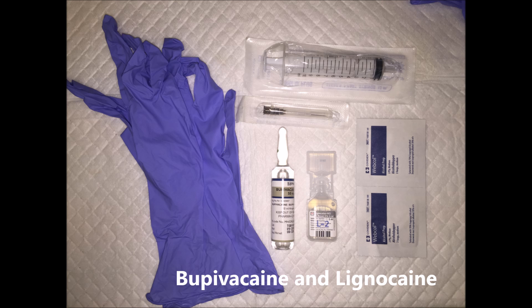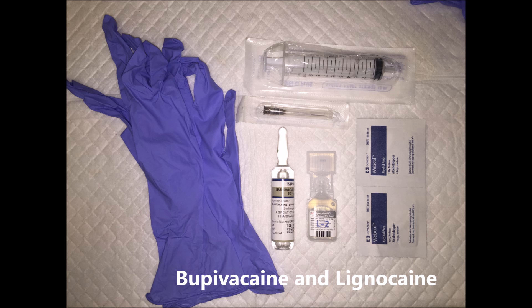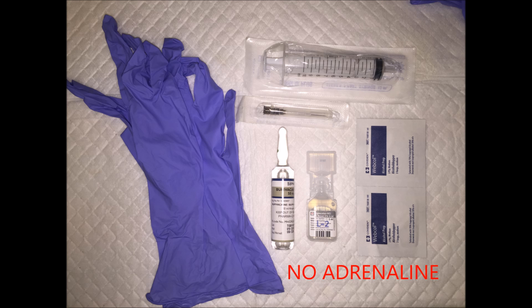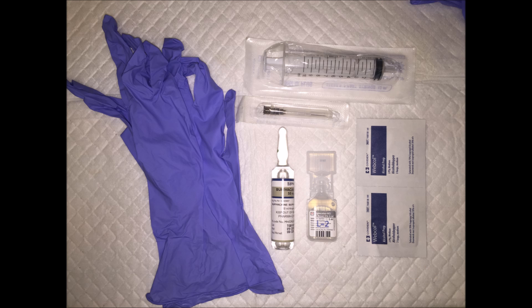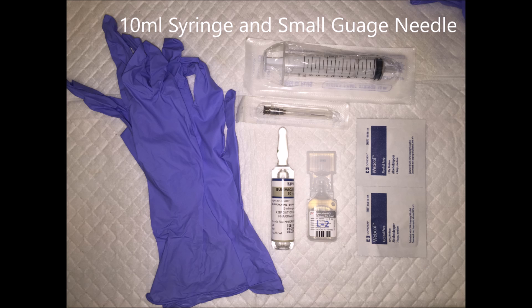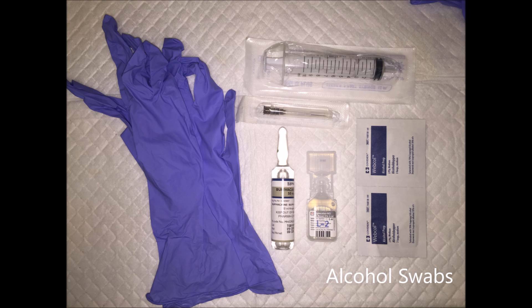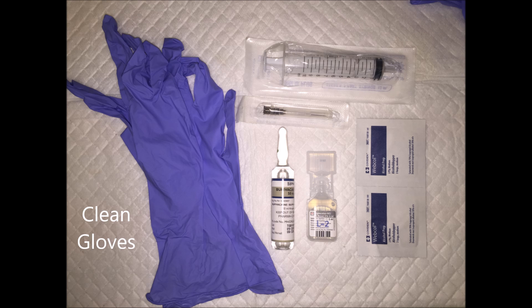Bupivacaine has a longer duration of action while lignocaine has a shorter time of onset. It is important to use lignocaine without adrenaline, as it is theorized to cause arterial constriction and ischemia of the finger. We will be using 5ml of each solution in a 10ml syringe with small needles. We also need some alcohol swabs and gloves.